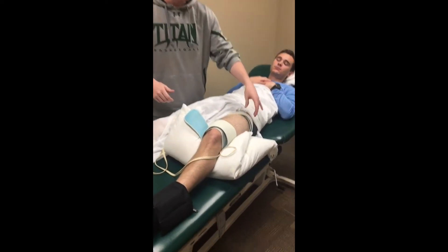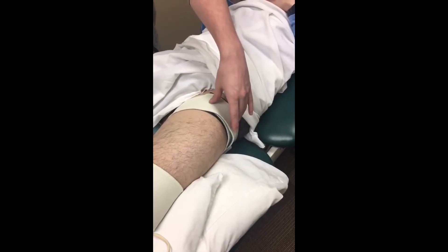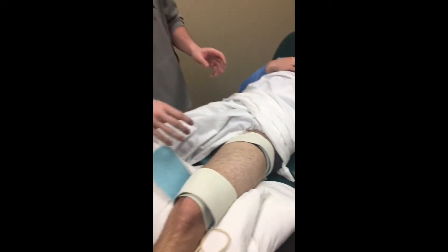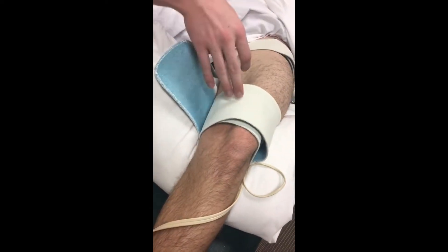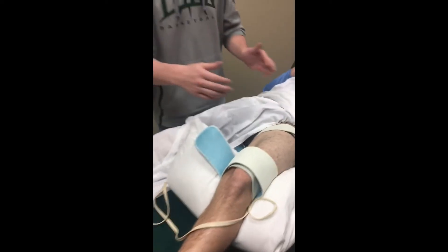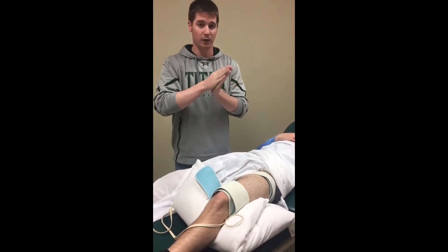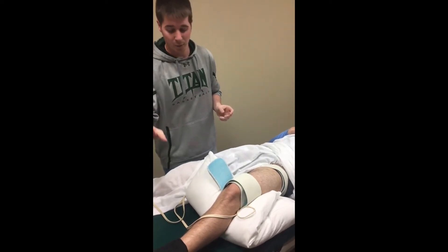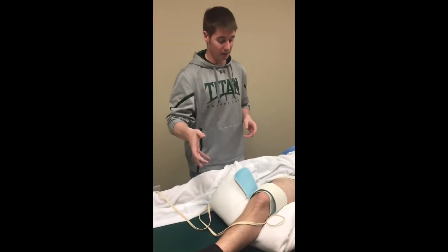We placed the larger electrode up at the femoral triangle on the lateral quadriceps, just to stimulate that nerve and get all the quadriceps. And then on the medial side at that fleshy part of the VMO, we strapped them on to get that electrode current there strong.